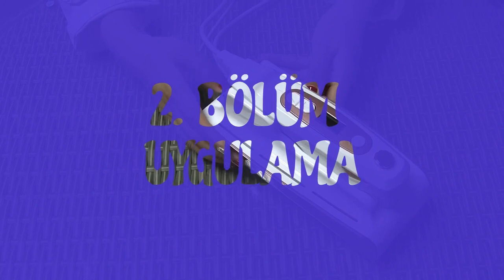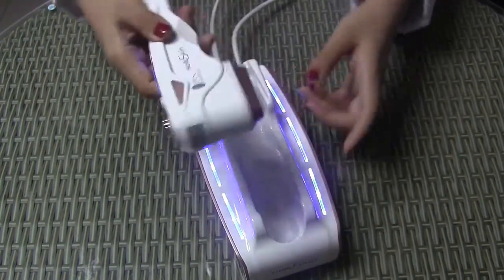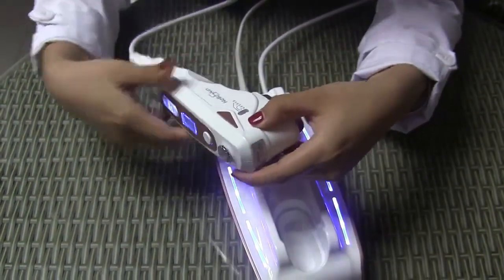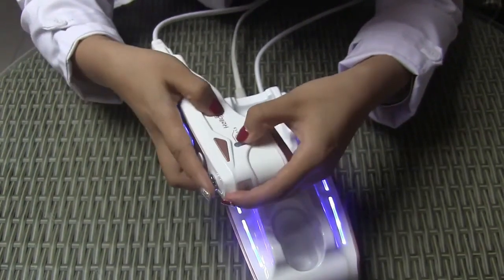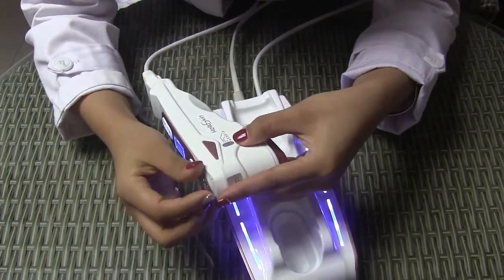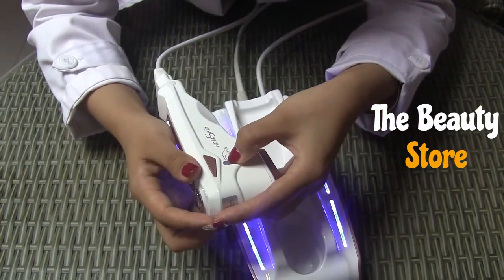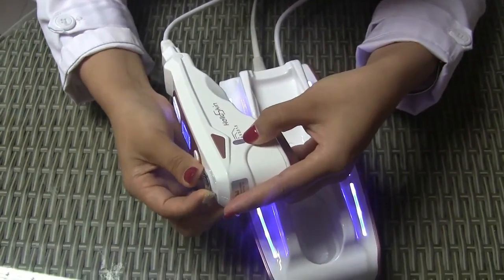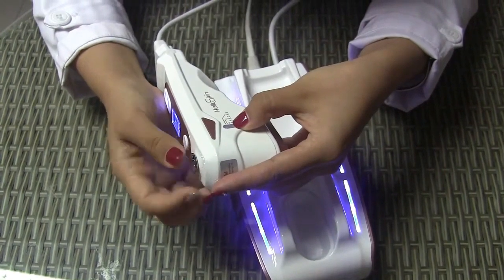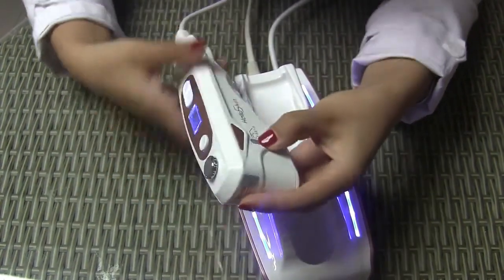Firstly, you need to press this power button and the machine is on. This button is used for adjusting the depth, and the red light equals the depth. Now it is 1.5 and we adjust it to 3. You can see the red light equals 3 and we adjust it to 4.5. And it equals 4.5.